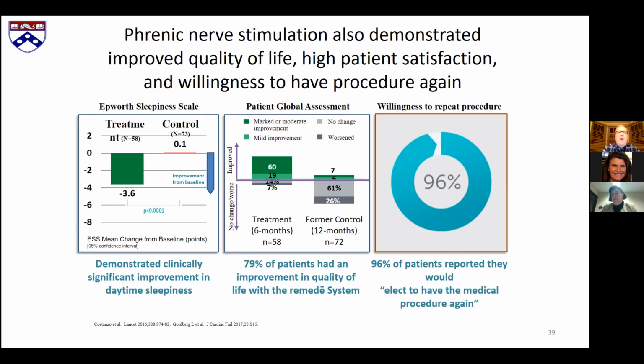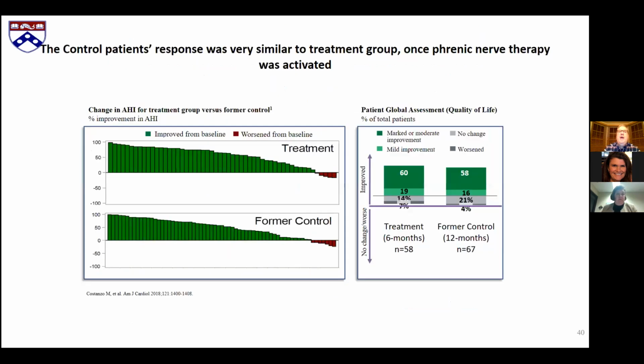In this first panel, you'll see that on treatment, the Epworth sleepiness scale number went down. That's actually an improvement in daytime sleepiness. 79% of the patients had an improvement in their quality of life. And then again, 96% said that they would undergo the procedure again.